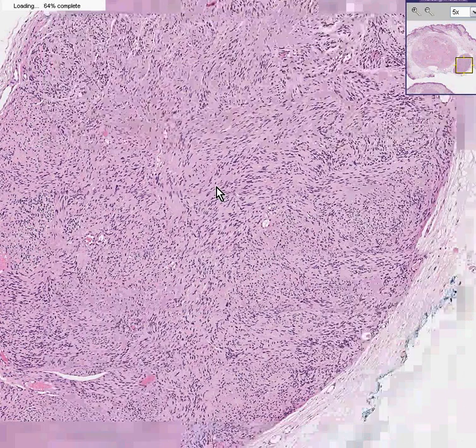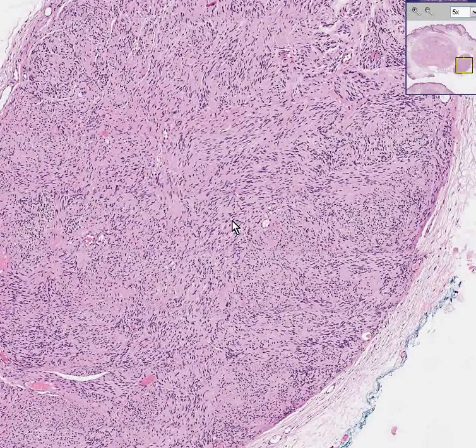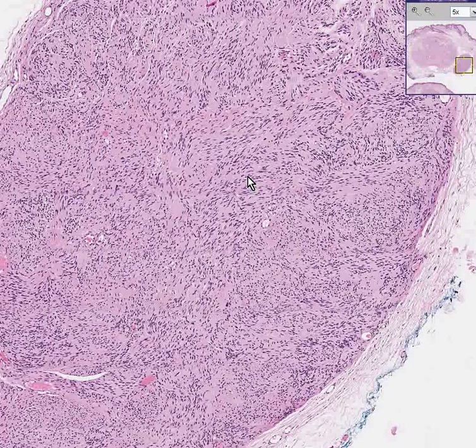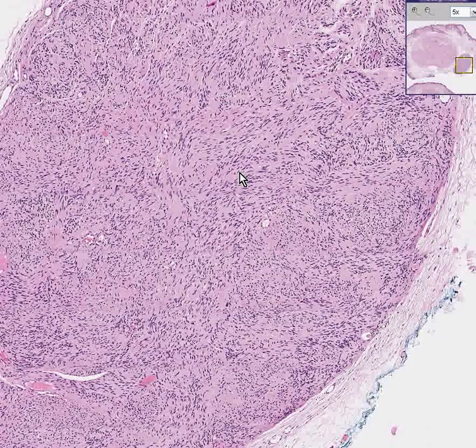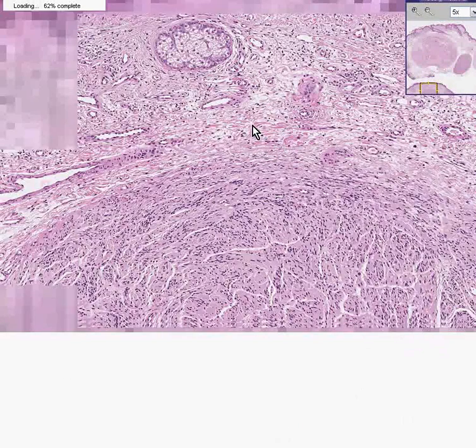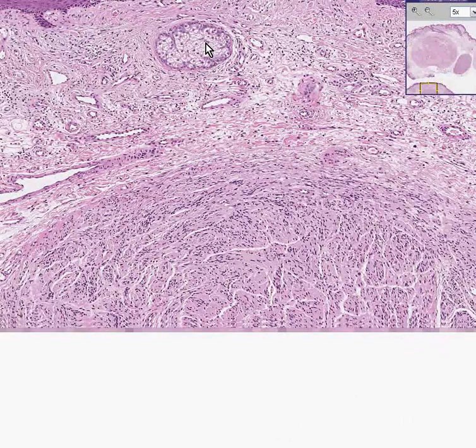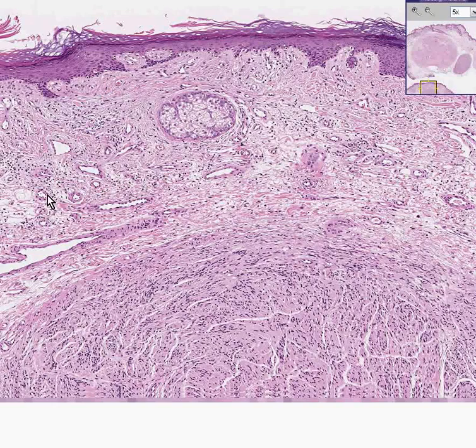Here's another little nodule. Notice there aren't too many Antoni B areas, but you do see some palisading around here, which is so classical for Schwannomas that palisading Schwann cells are basically synonymous with the term Schwannoma. Here's another area — you can see it's right underneath the skin. You can see a sebaceous gland, some veins and perhaps lymphatics, and a couple of small arteries here in the skin.